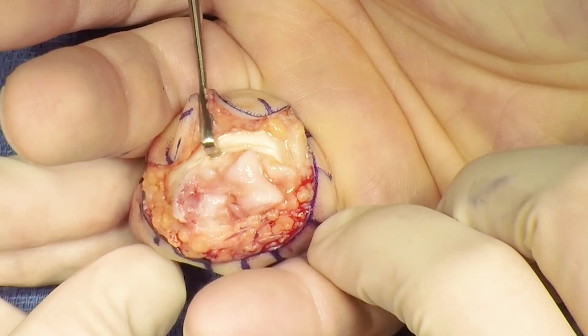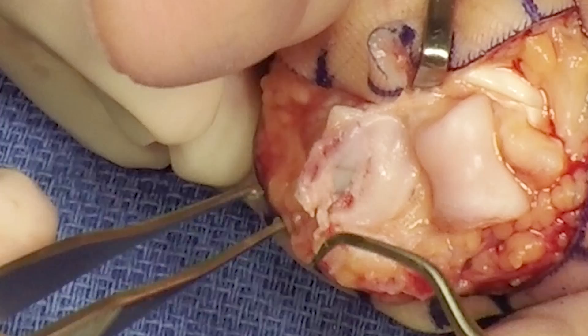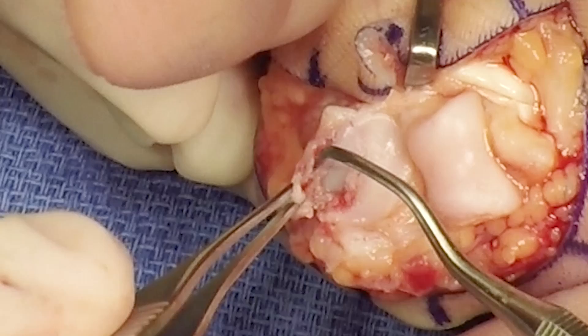The joint is then hyperextended and shotgunned open. At this point, the volar rim fracture as well as the articular impaction is easily appreciated.